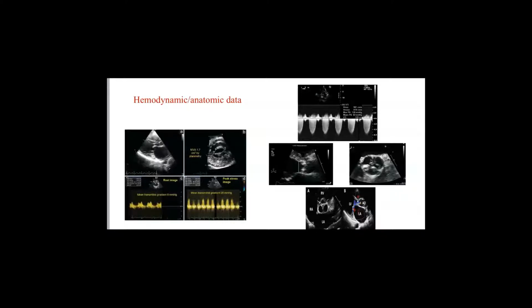So sometimes there is discrepancy. And here comes the job of the echocardiologist. When you have discrepancy, you know how to sort out this discrepancy, how to settle the disputes, how to make reconciliation. For example, if you have a morphologically stenotic aortic valve, but the mean gradient is lower than 40. So what are you going to do here?